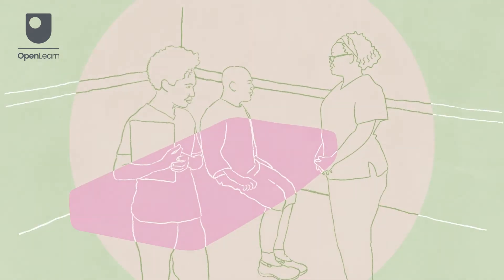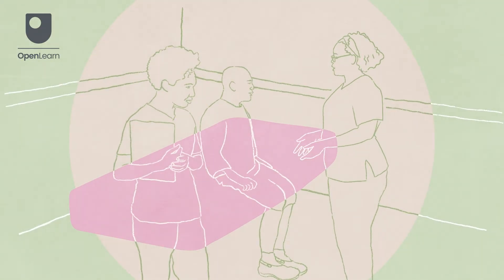If the patient is able they should sit in an upright position as this will promote optimal lung expansion. You may need to ask the patient to remove or loosen any clothing that covers the chest area.